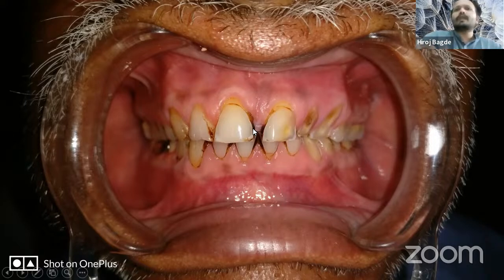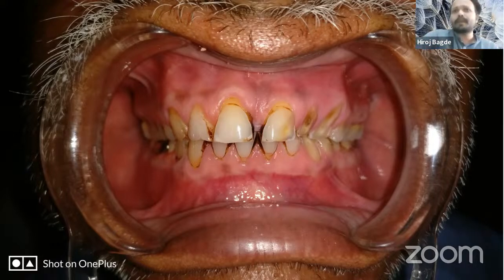I focused on this. You can see some harsh light in the form of lines here. It is a harsh light produced by mobile photography, where even after using a diffuser, there is some amount of harshness here. Can you see the harsh nature of the light? We want details, but details will be lost if the lights are not proper in the case of mobiles.